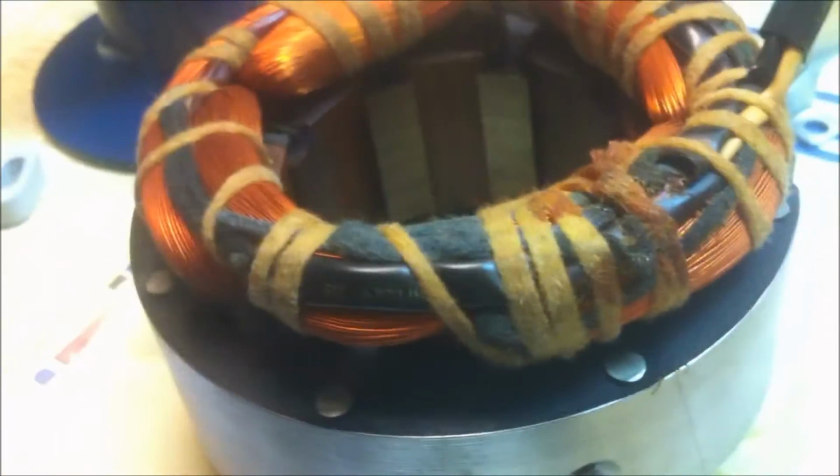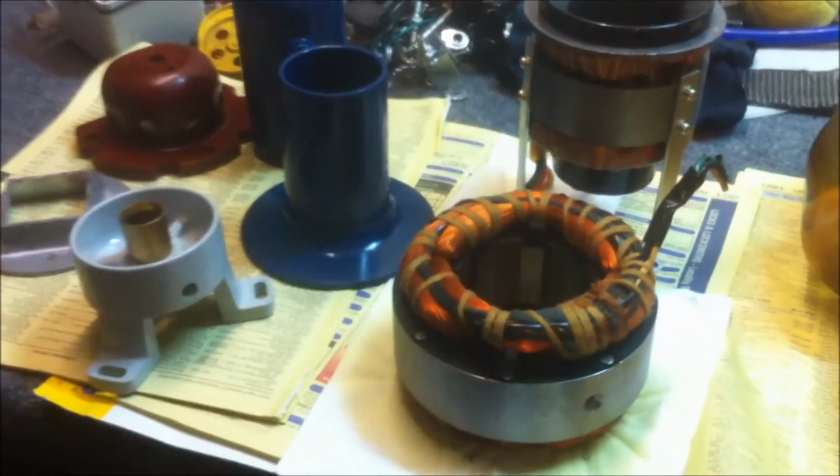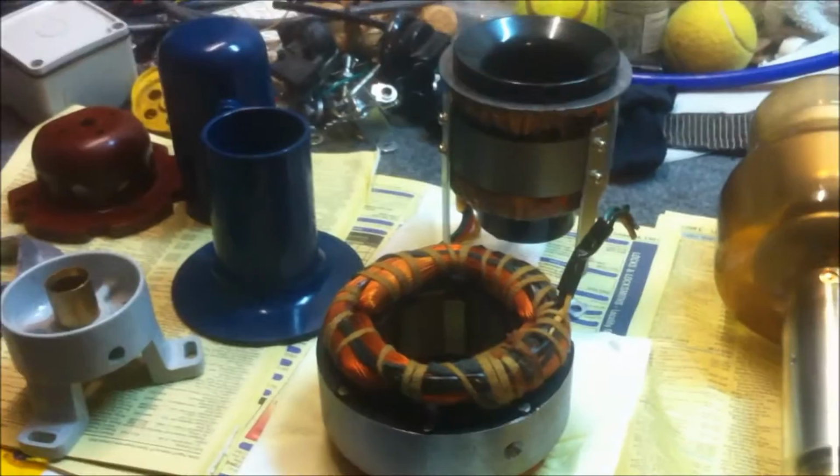So there you go. It's still leaking oil. You can see down there it's all sort of yellowy. You can see all the oil just leaching out of that coil. Gone through about 20 of these little serviette things. Still going. But yeah, so that's a pretty useful bunch of parts there.